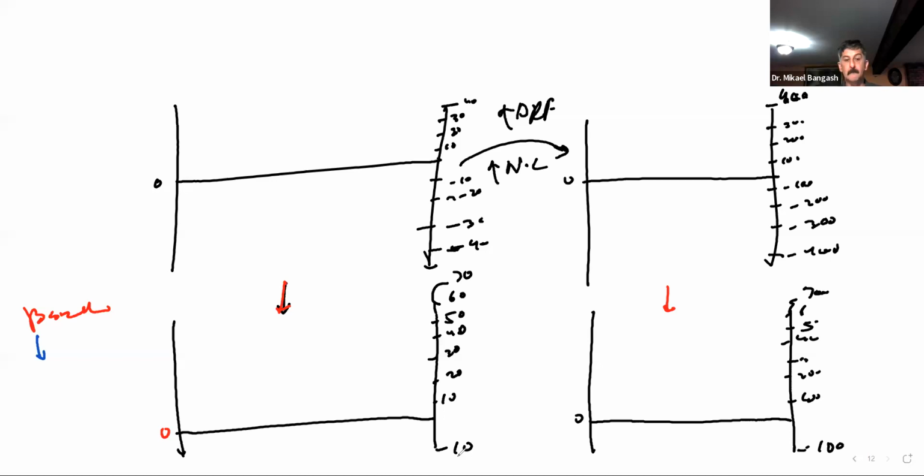Okay. But where you saw on the positive side, it went from 40 to 70, you had less negative Doppler shift. But if this was your scale that you had set, and you did a similar baseline shift, otherwise it would have been 400 plus, 400 minus.